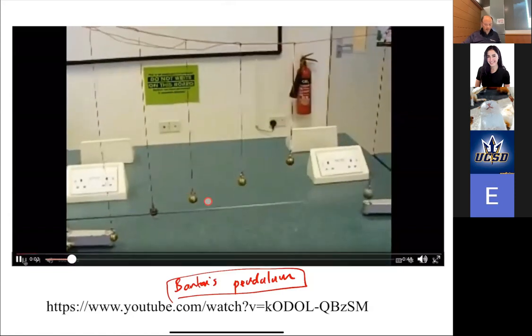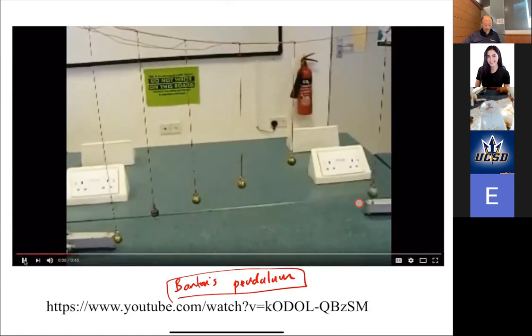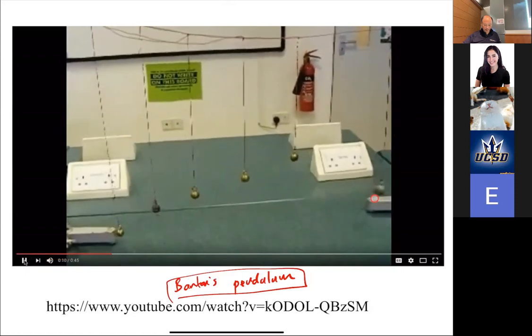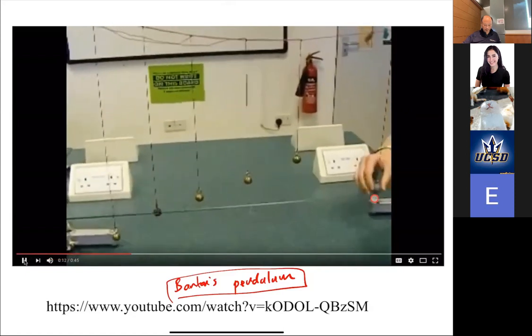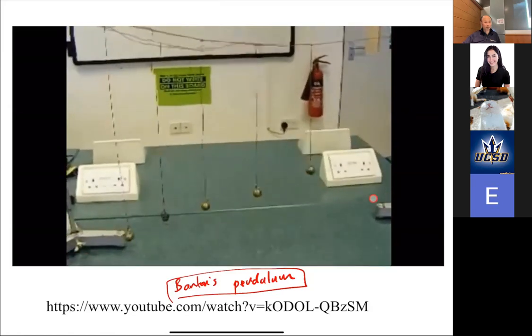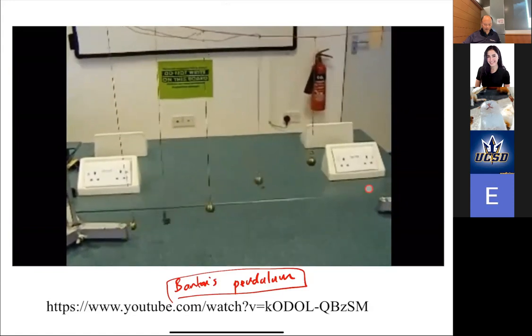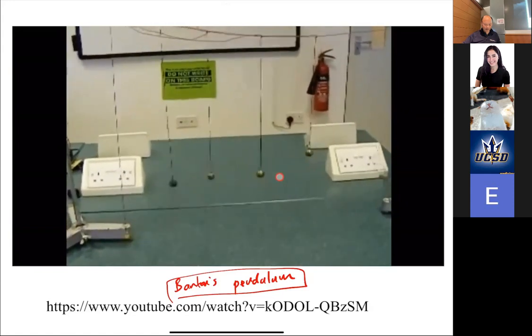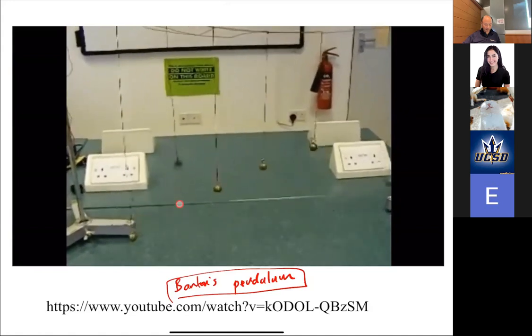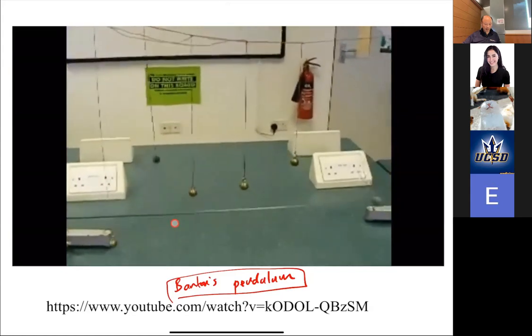So here, it's just random motion. At some point, I think right around now, you'll see a hand come in here. Let's see. There we go. There's a hand, and it lets go. So that's the RF pulse, right? And so it's oscillating. You notice that it perturbs all of them a little bit, but over time, this is the only one here that is perturbed.